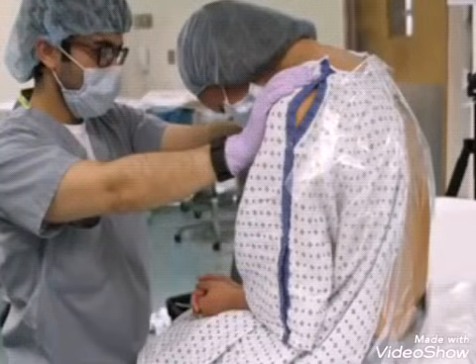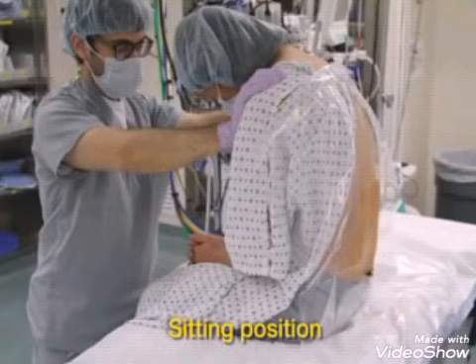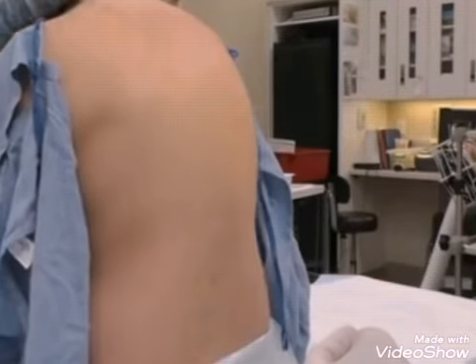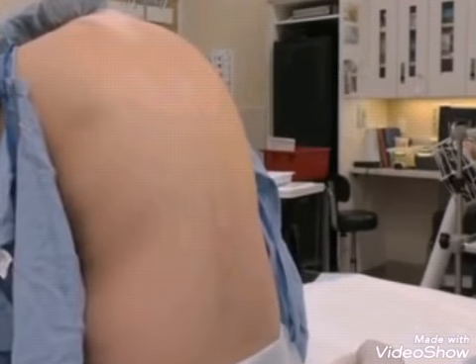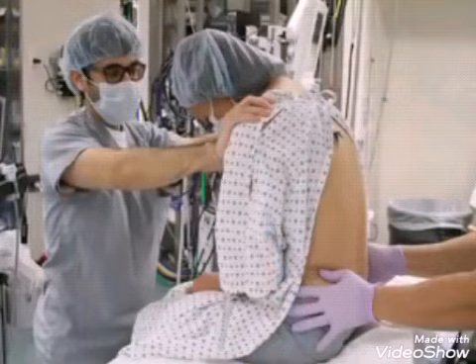Proper positioning of the patient is important to facilitate access to the epidural space. This video demonstrates placement of an epidural catheter while the patient is in the sitting position, which is commonly used. An alternative position, the lateral position, is not demonstrated in this video. To place the patient in the sitting position, have the patient maximally flex his or her back. Then instruct the patient to relax the shoulders, flex the neck, and lower the chin toward the chest.